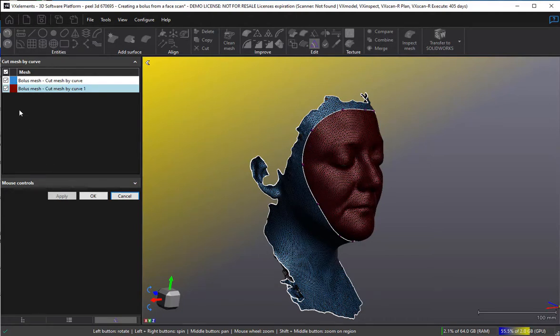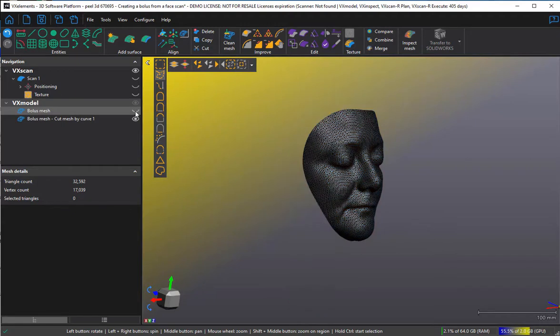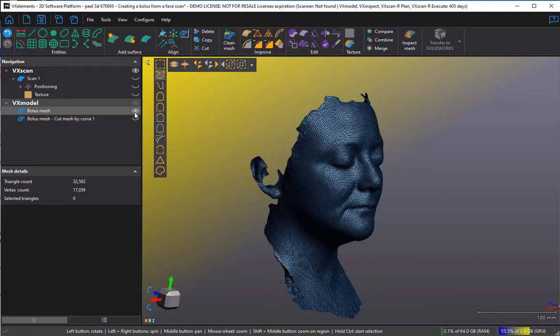I can see which part I want to keep and which I don't. I need to turn off the original scan. Now we have the face mask, which is the bolus mesh, and the cut mesh by curve, which is the remainder.